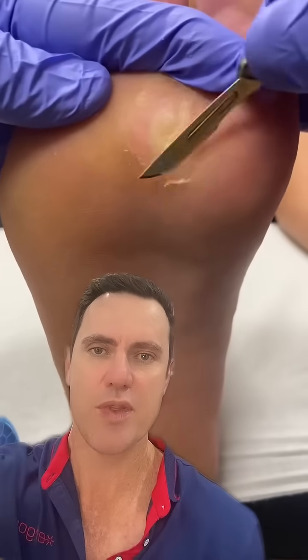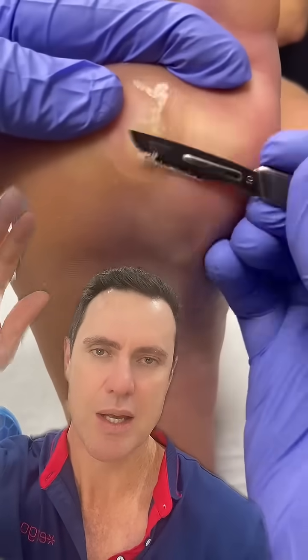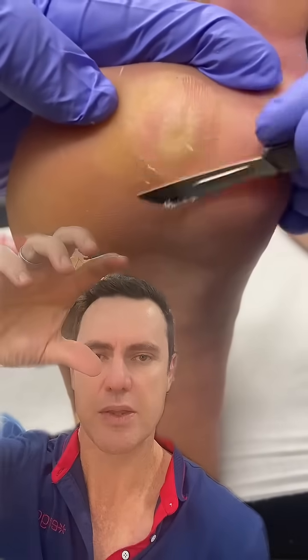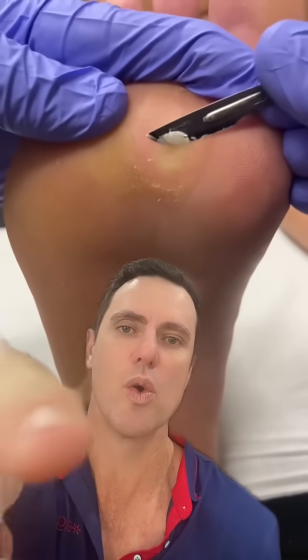What we do is remove the callus cap and then enucleate the corn underneath. You can see me just removing that callus cap. If we think of the corn like an ice cream — the ice cream is sitting outside the foot and the cone sits inside the foot — the cone is the corn.